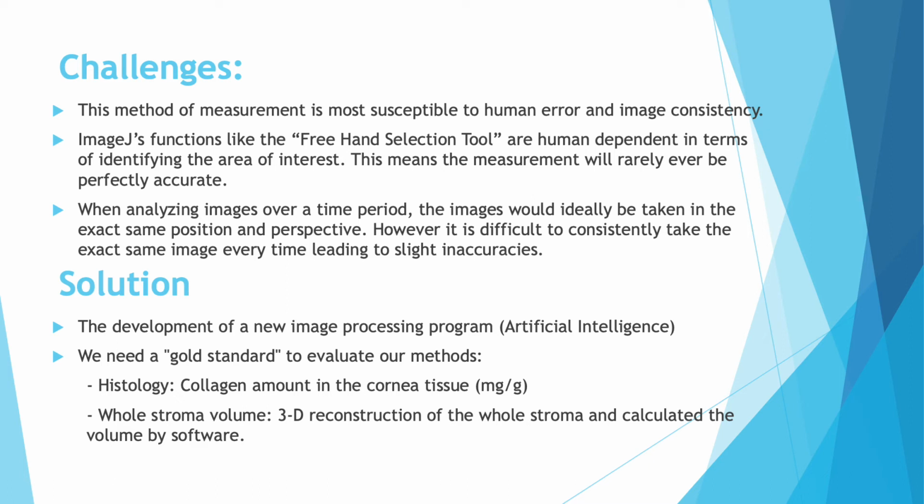When analyzing images over a time period, the images would be ideally taken in the exact same position and perspective. However, after 2 weeks or 4 weeks away from your experiment, it is difficult to consistently take the exact same image every time, leading to slight inaccuracies. The solution includes the development of a new image processing program. We need a gold standard to evaluate our methods.